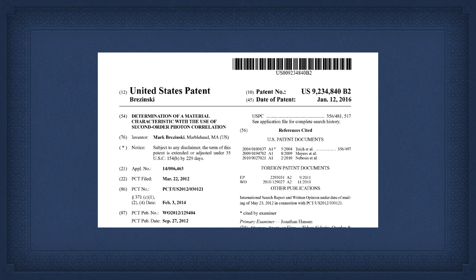But it's very good at differentiating lipid versus water. And we're looking for necrotic cores which have lipid in them, and we want to differentiate them from hard plaques which don't have lipid from within the sample, but not being affected passing through the intima that comes before the core. Powerful technology. In some areas, could this replace OCT?